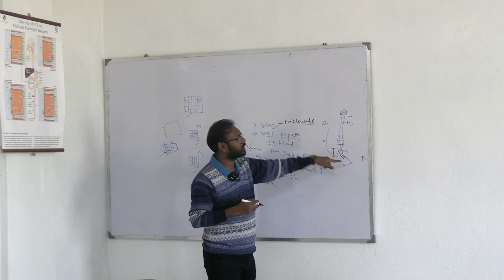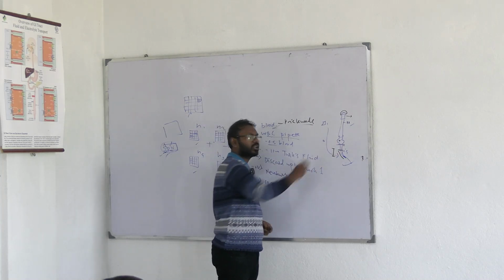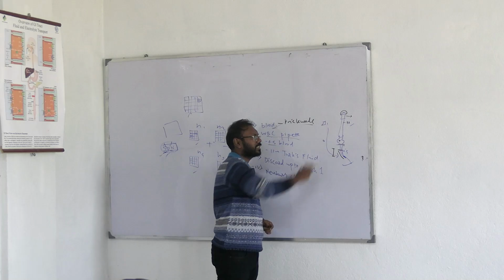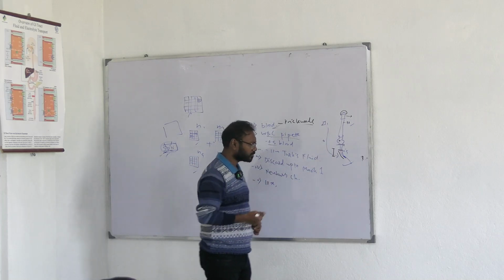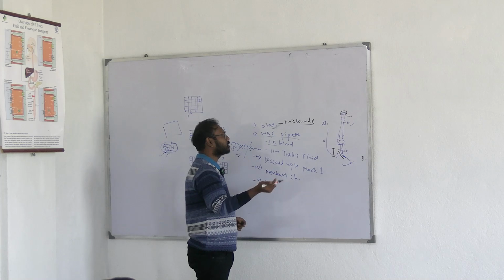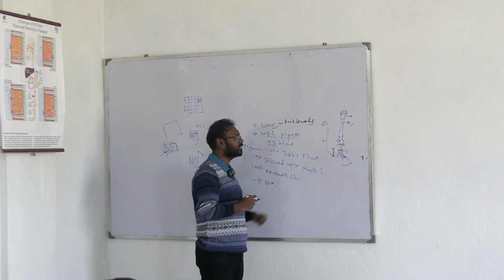0.5 is important, not more than that. You should not take more than that, and if it becomes less than that, you should not take less than that either. If it becomes more or less, it will affect the calculation. So next, up to 11 you have a special fluid for this test.